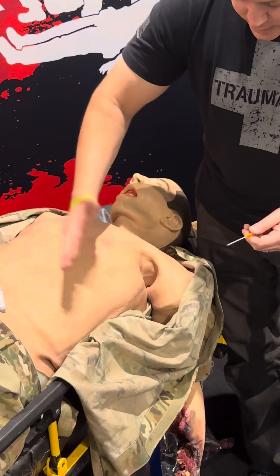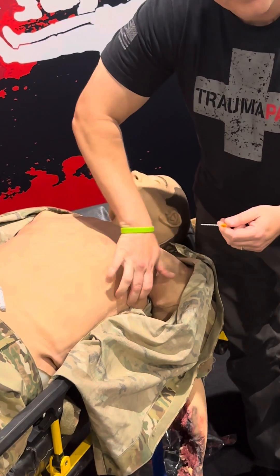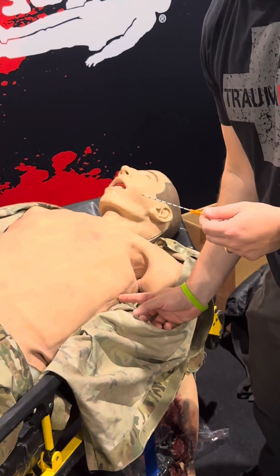I come over here. I like to find my landmark by putting my hand in here — where my pinky is is typically the fourth or fifth intercostal space in the mid-axillary line.